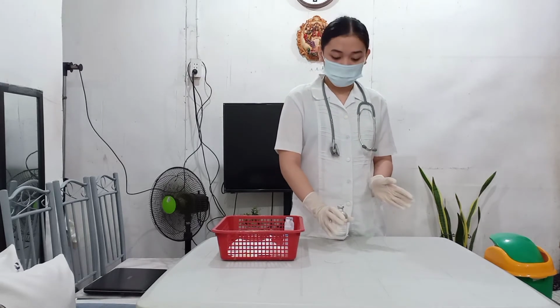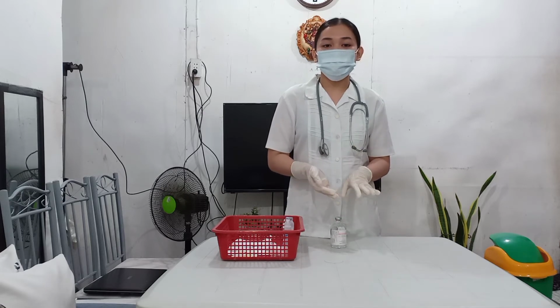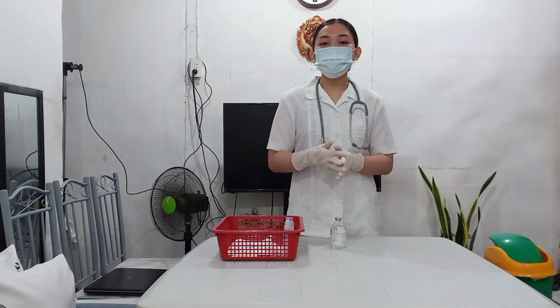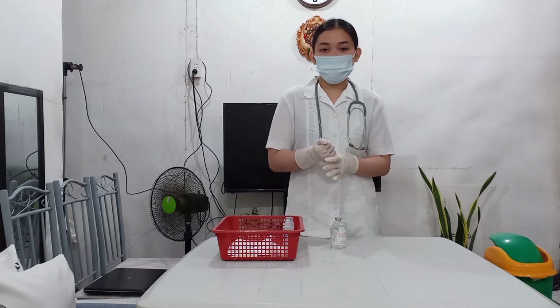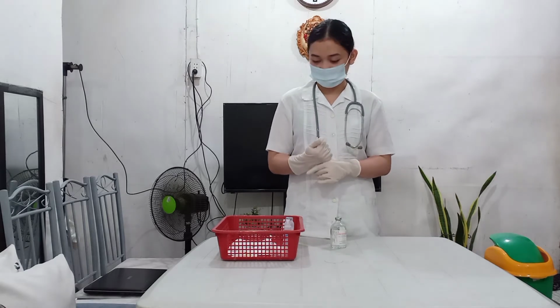After which, I will place the vial here on the surface and I will remove the protective cap or clean the rubber cap of a previously opened vial with an antiseptic wipe by rubbing in a circular motion. The protective cap or the clean rubber cap on the vial protects the self-sealing stopper. It is important to clean the rubber cap to avoid contamination.